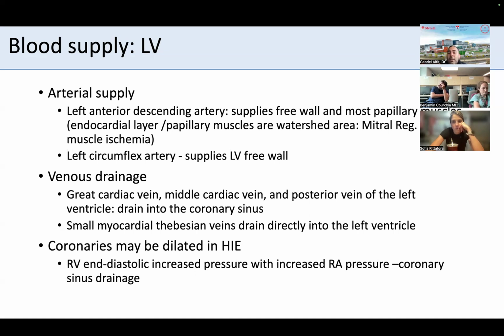What we see in functional diseases is issues where your coronary may not be well perfused. So think about lesions that will steal from your coronary. So large PDA could potentially do that. Patients with a lot of steal like vein of Galen malformation or other types of lesions like aortic insufficiency. And then the venous drainage typically will occur to the coronary sinus, which typically will go to the right atrium. And there's a small little valve that's called a Thebesian valve, which will close off the coronary level.